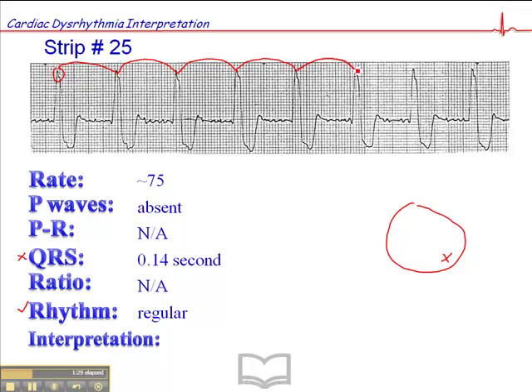Could it be a junctional rhythm, because we don't see P waves? Again, the answer is no, because if there are no P waves and the QRS is wide, then we have to assume that the focus is coming from the ventricles.